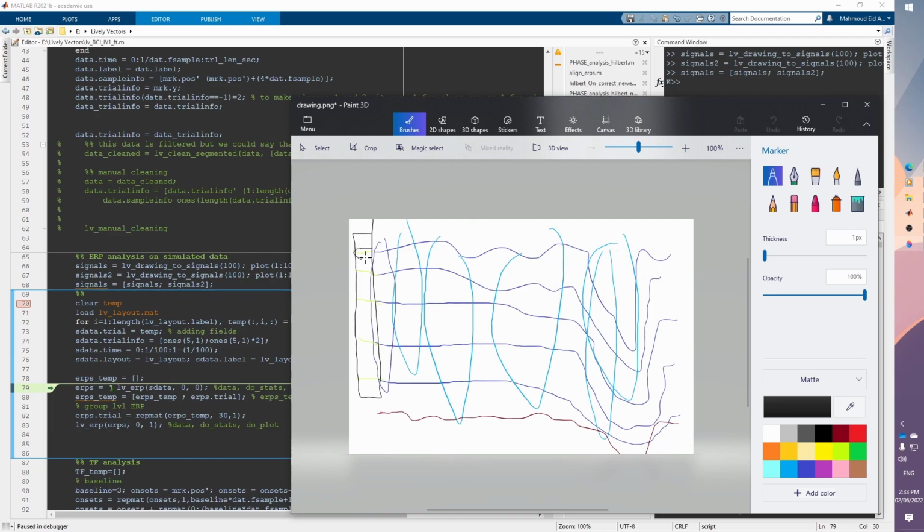sample. So basically we take the average of this, you will have one data point, and then you subtract this baseline from every sample. And this is nice because the baseline is basically some period in time that you guarantee that there is no activity relevant to the task in hand. So basically, if the participant is doing task A in these 5 signals, or task B or anything, you should guarantee that this baseline doesn't have task A being performed during this duration. And you take the average of this and you just subtract it.